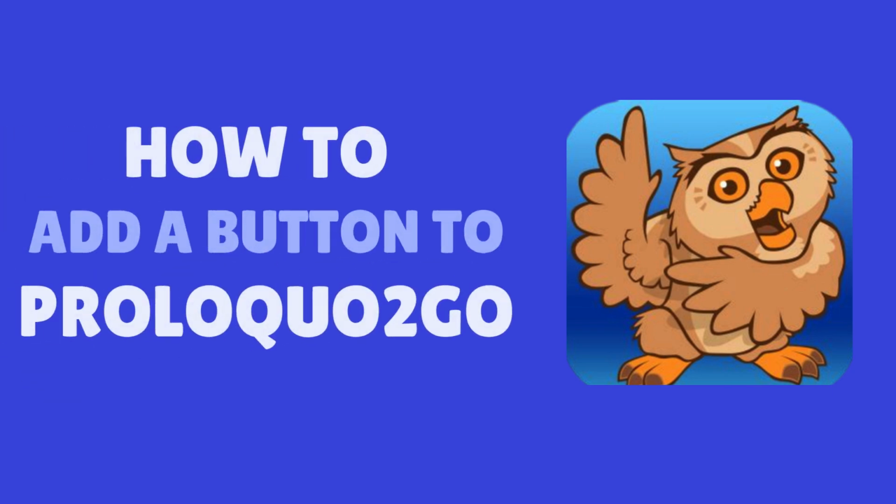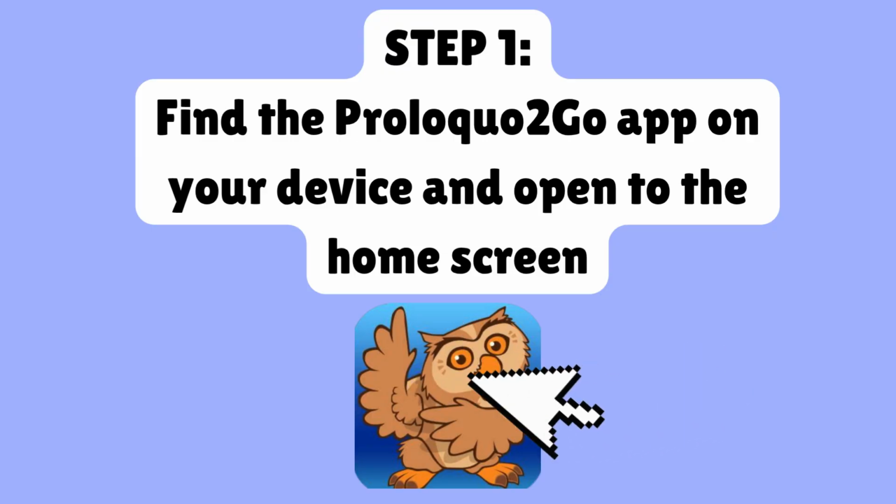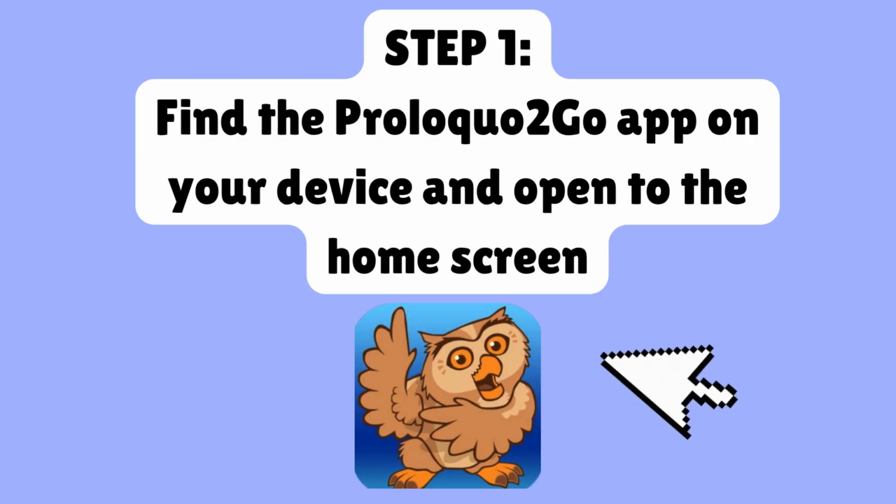How to add a button to Proloquo2Go. Step 1. Find the Proloquo2Go app on your device and open to the home screen.